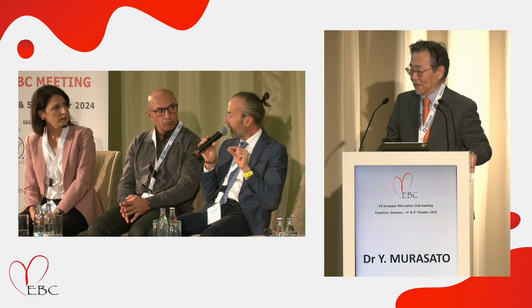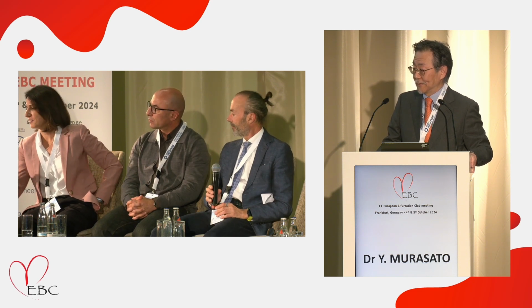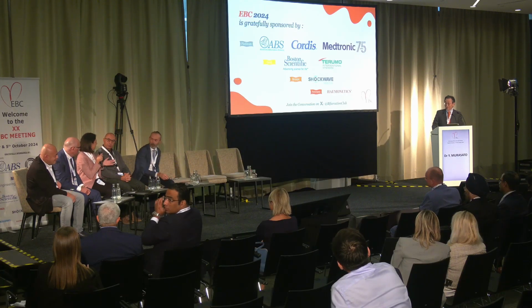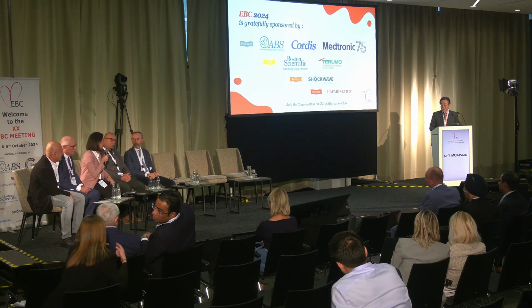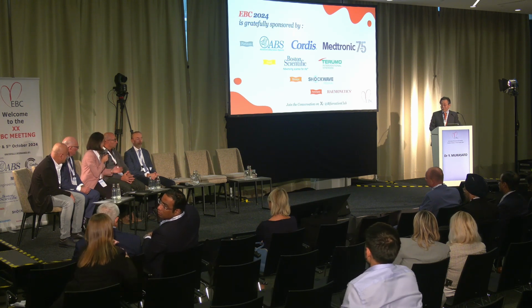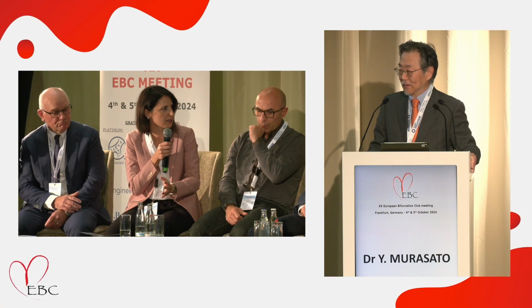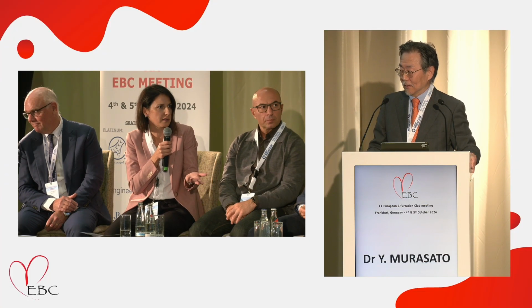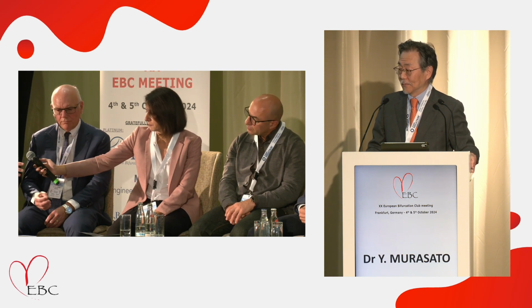Yes, it's important to underline this, because if there is some left main disease, it's better at least to stent from the left main to the LAD. Usually when there is ostial LAD and ostial circumflex disease, for sure there is also distal left main disease, probably in 80% or even more, according to the IVUS studies. Probably that was your reason to do this procedure. I don't know. Thank you.